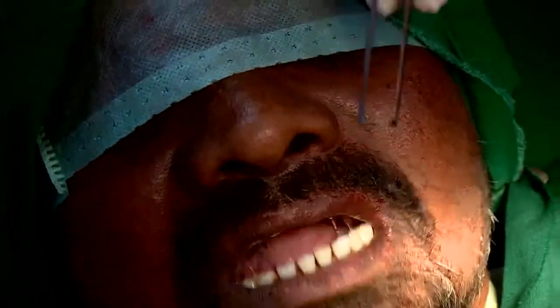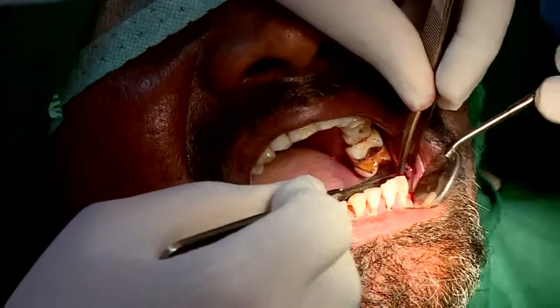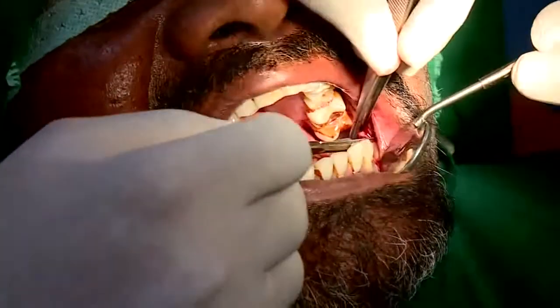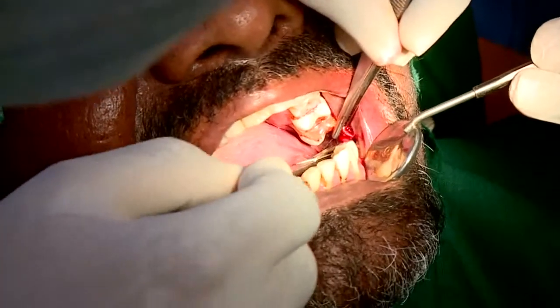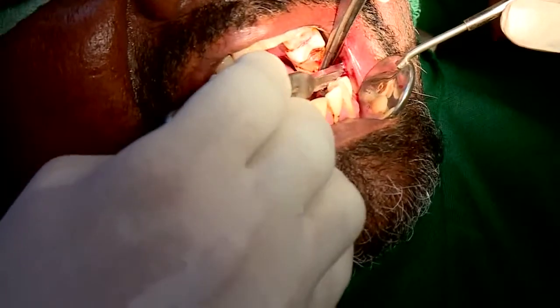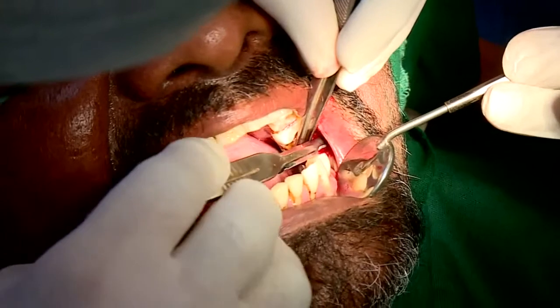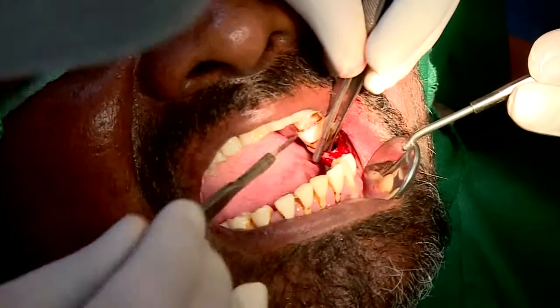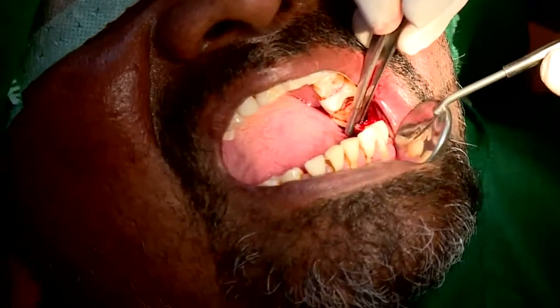Trying to just achieve some hemostasis. Shallower, broader biopsies are indicated in a particular type of lesion, vesiculobullous lesions. We can go in for an explanation of shallower, broader biopsies there.